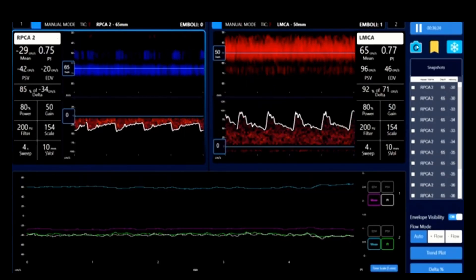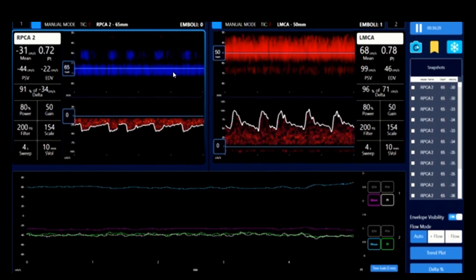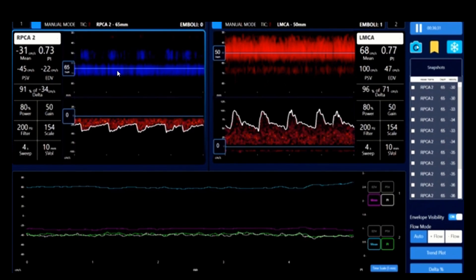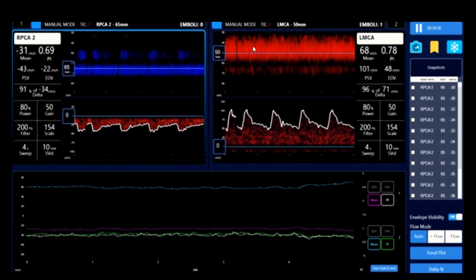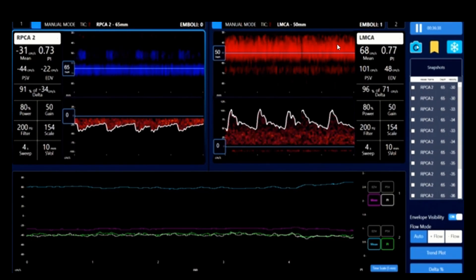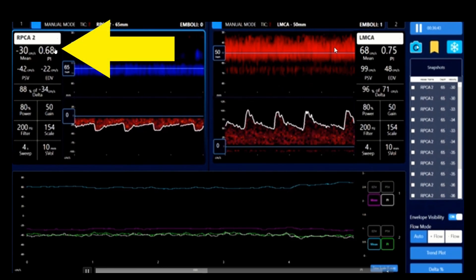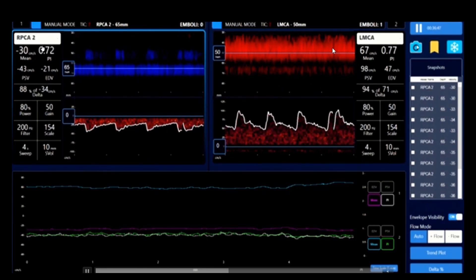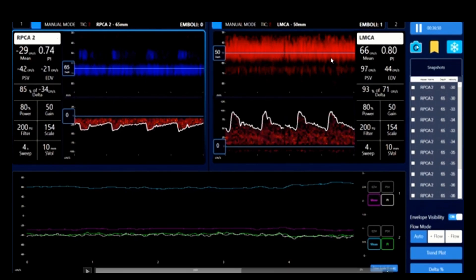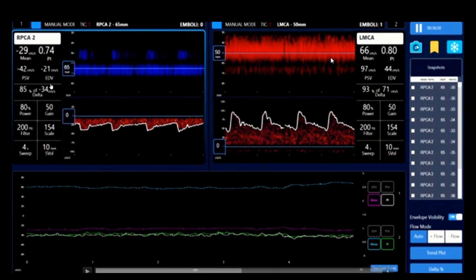Let's take a moment to review the TCD screen. The blood in the P2 segment of the PCA flows away from the probe, which is why the M-mode signal appears blue. The blood in the MCA flows towards the probe, making the M-mode signal red. We monitor the mean flow velocities, the pulsatility index or PI values — which are an indirect indicator of vasoconstriction and vasodilation in the brain — the delta percentage, which indicates the percentage change of the current mean flow velocity compared to the baseline, and the number of emboli.